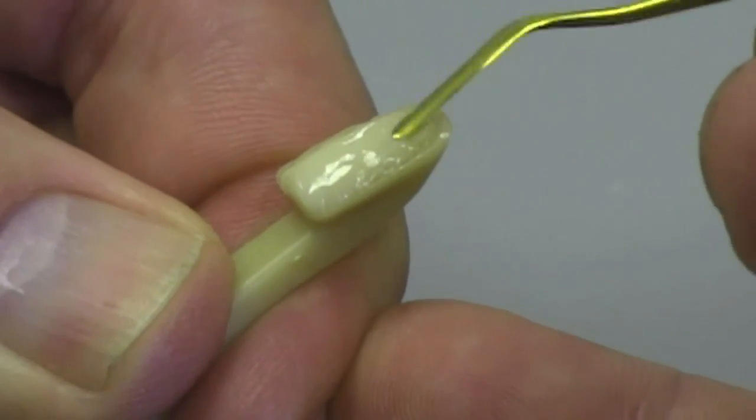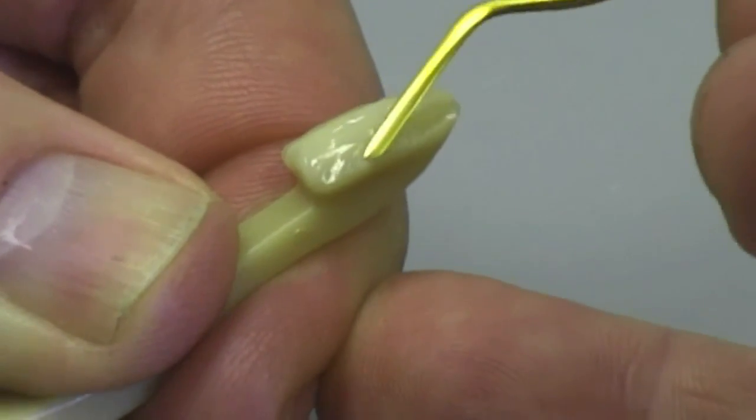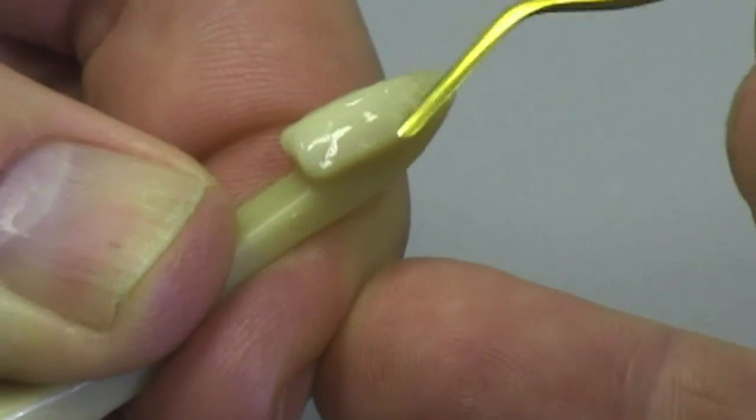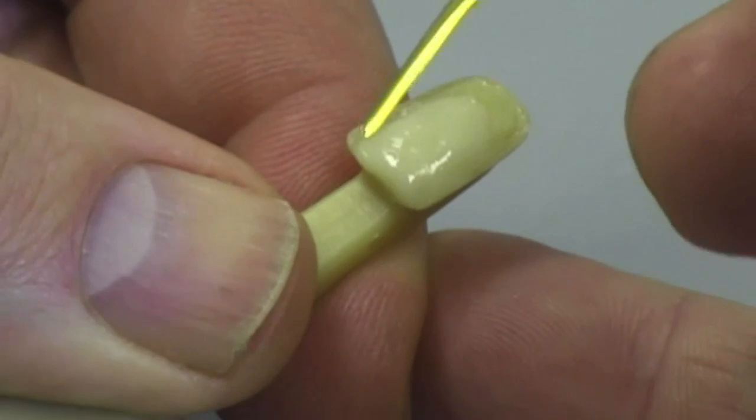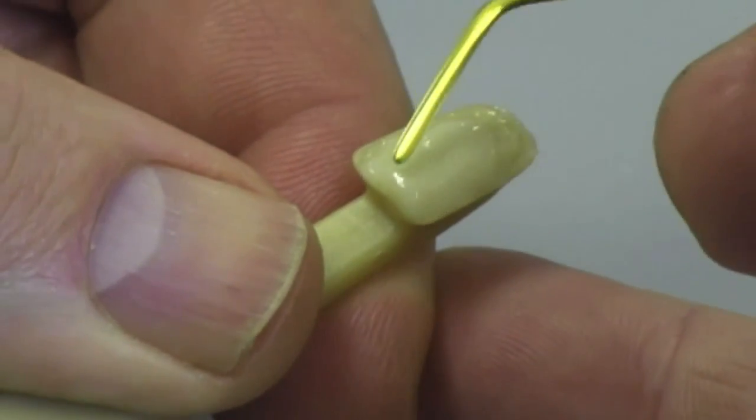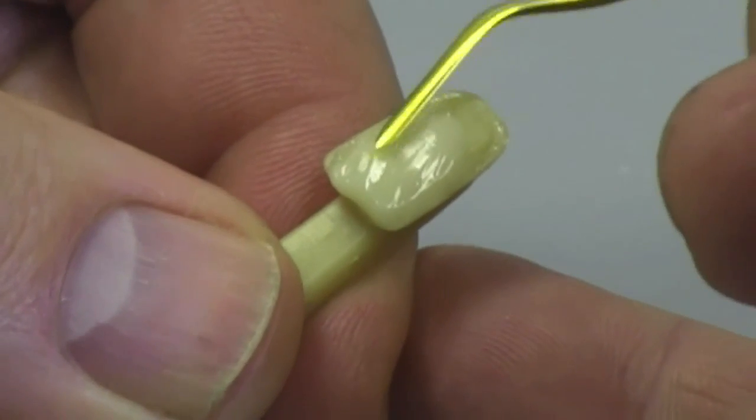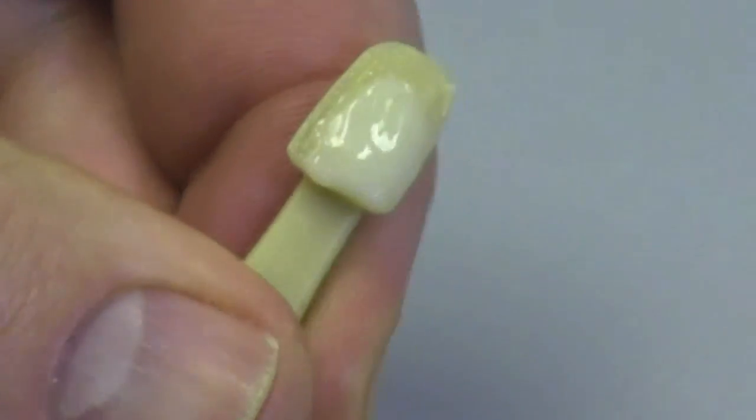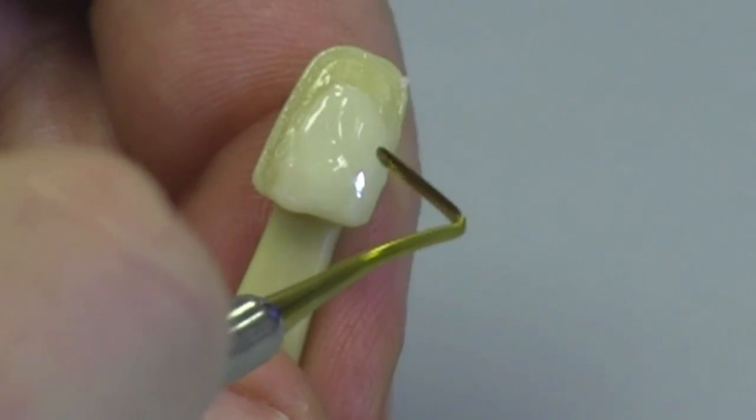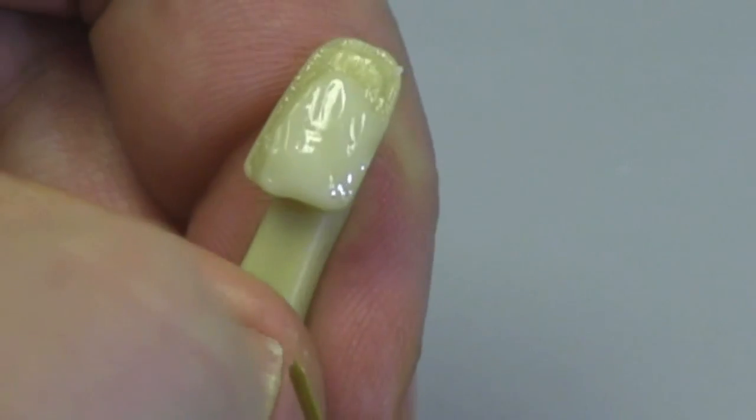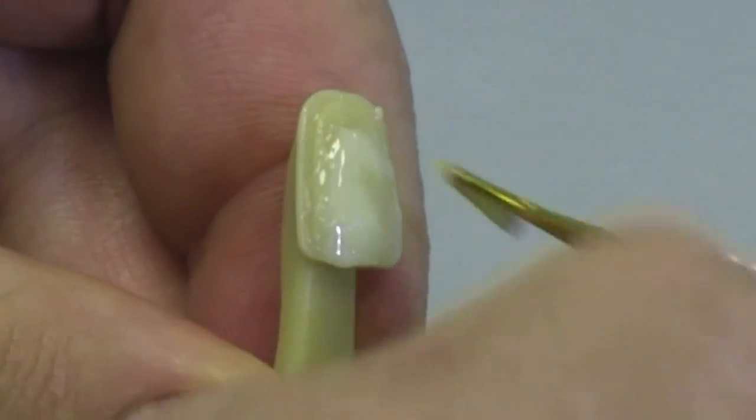And if I take my time to blend this material, the key factor in avoiding air bubbles is to make sure that this material isn't allowed to fold over onto itself or onto the underlying tooth structure in a way that could trap air. So gently, almost massaging or teasing this material so that you're able to avoid trapping air is a critical component. You can see how the surface here has a shiny luster. If you allow that material just to set there for 30 seconds or so, it'll self-level quite nicely.